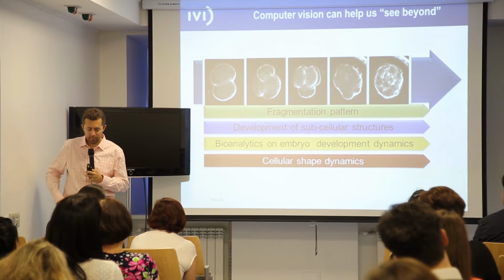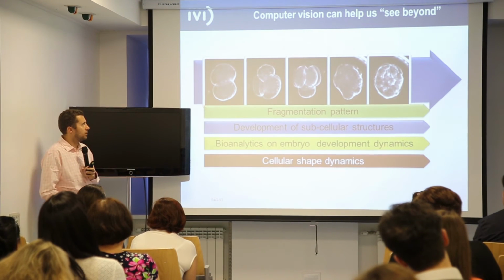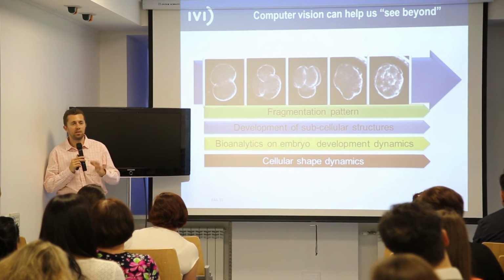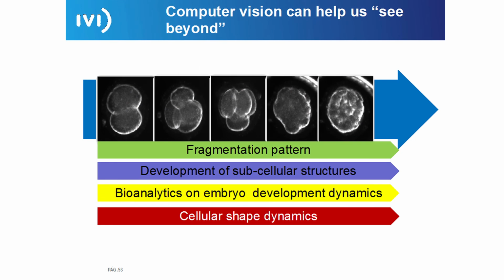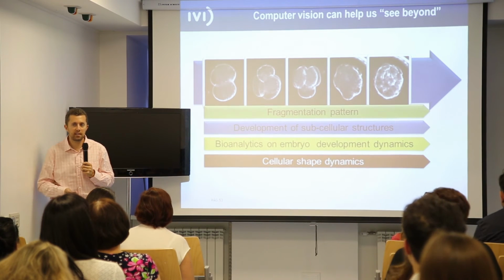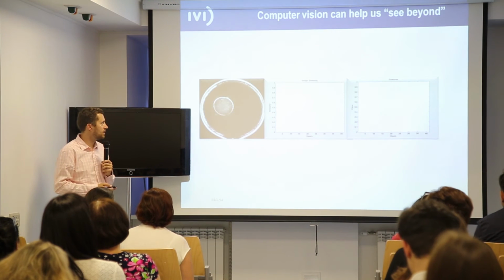So again, just thinking in the future, what we can see beyond the standard of evaluation. Maybe with the software, we can study fragmentation patterns I have explained to you. We can study other structures. We can see embryo dynamics. We can see changes in shape.